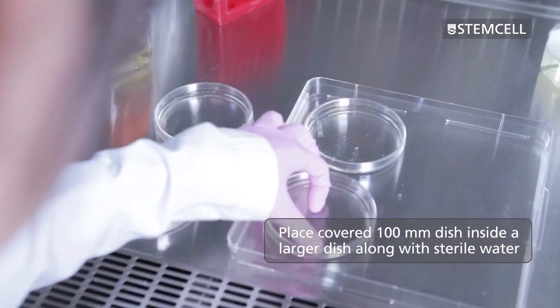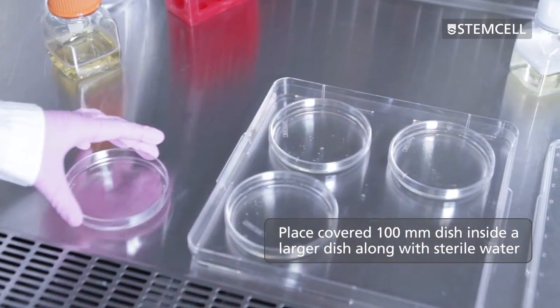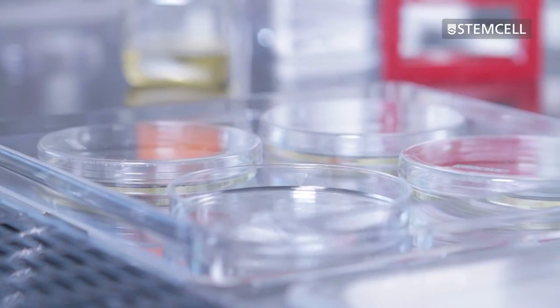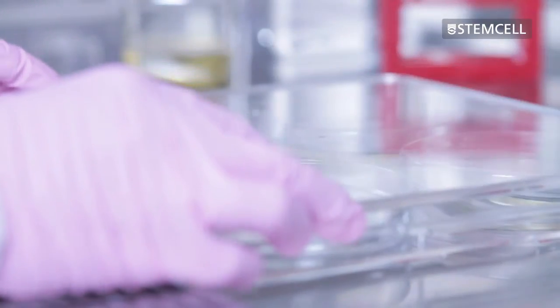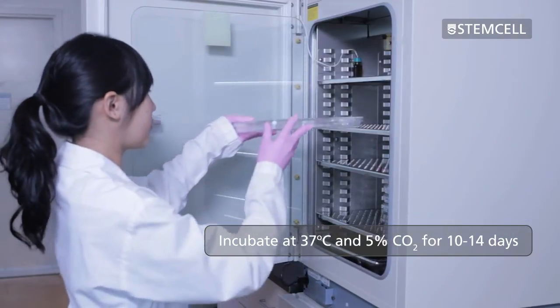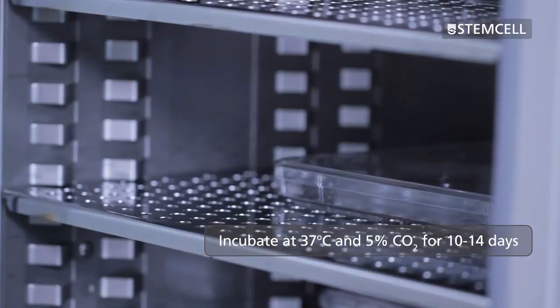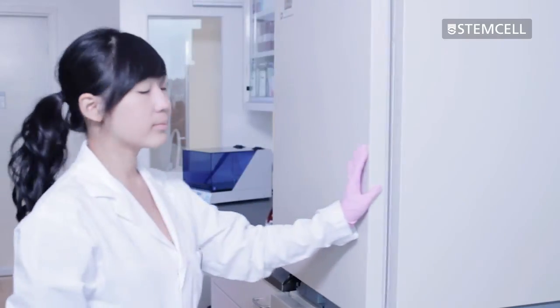The covered 100 millimetre dishes may be placed inside a larger dish along with an uncovered dish of sterile water to help ensure that the cultures are well humidified. Place the cover on the large dish and incubate the cultures at 37 degrees Celsius and 5% CO₂ for 10 to 14 days. It's important that the cultures are not disturbed during this incubation period.